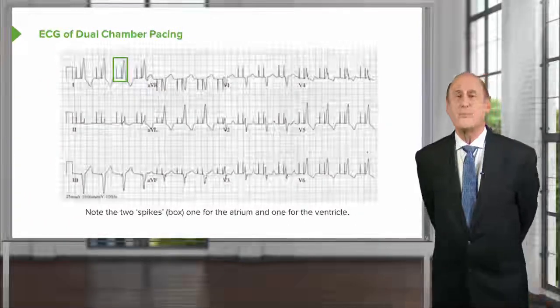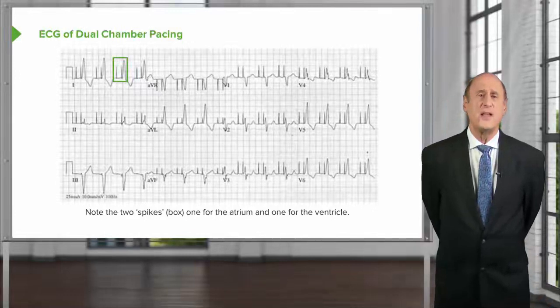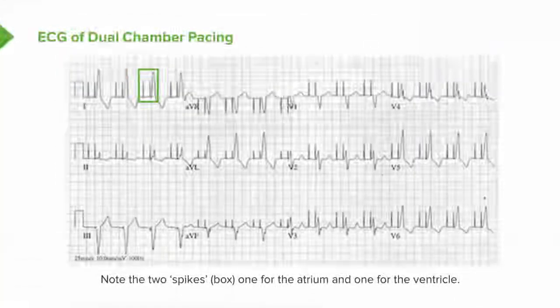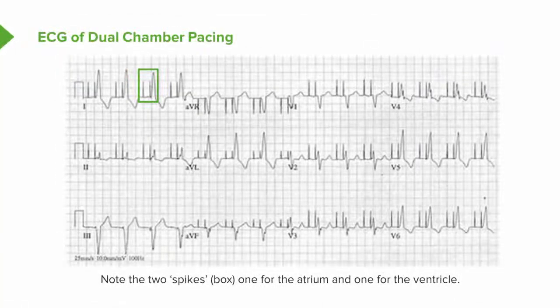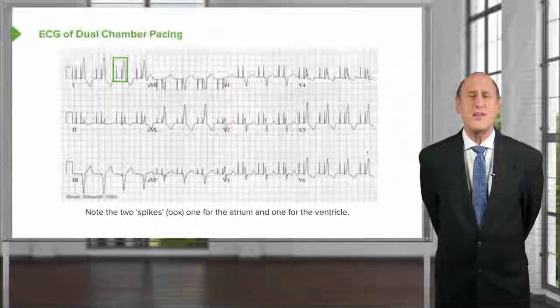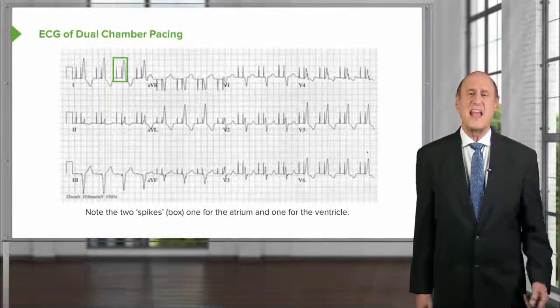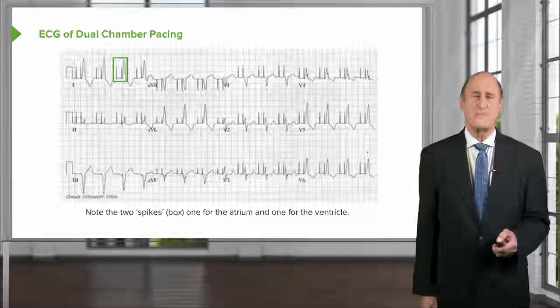So this is an EKG from a patient who is being continuously atrial and ventricular paced. Notice, particularly look at the top line. This is a regular 12-lead ECG. Look at lead 1. Two pacer spikes, one where the atrium was and one for the ventricle. And then as you move across to AVR, again, two spikes, atrial and ventricle. You move across to V1, two spikes, atrial and ventricle, and then across to V4, two spikes, atrial and ventricle. So this is a patient being continuously paced atrially and ventricularly. So this is almost certainly a DDD pacemaker.